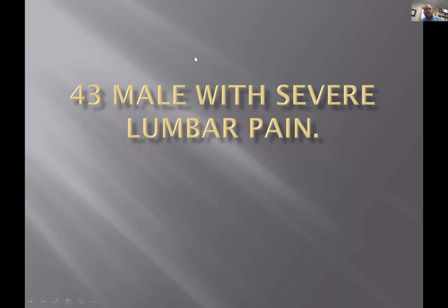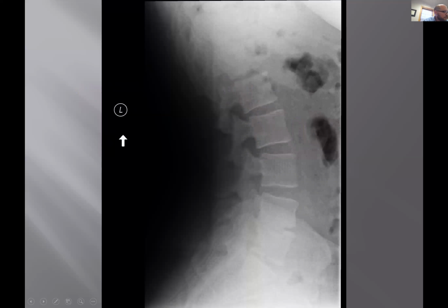Let's go on to the next case. 43-year-old male with severe lumbar pain. All right, we're going to go pretty quick on this one.